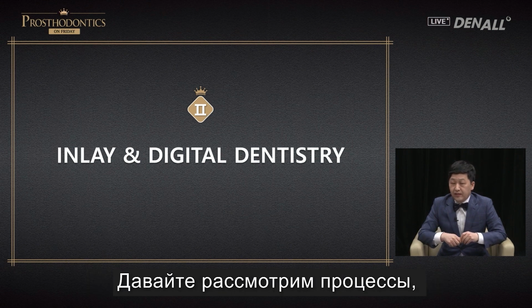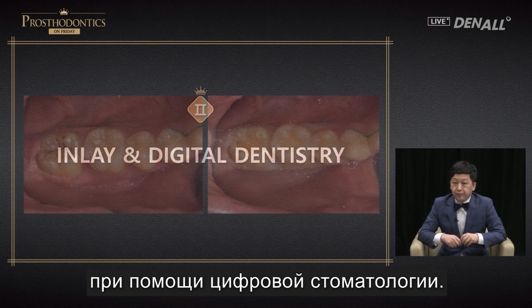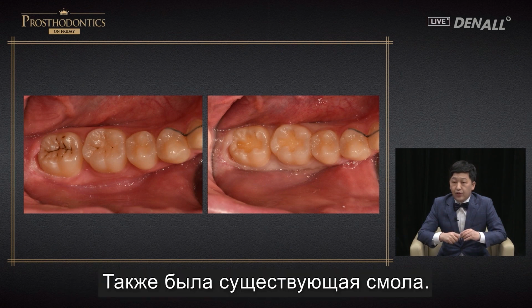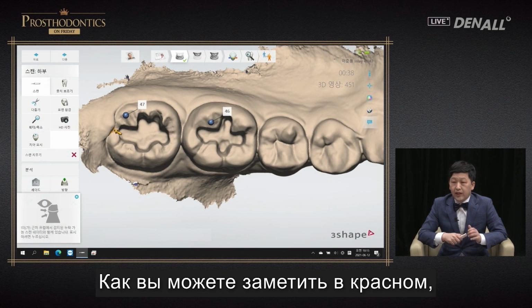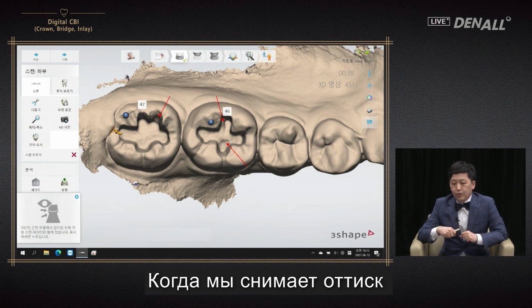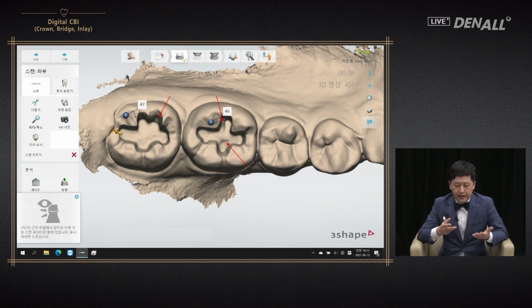Let's look at the processes involved in an inlay using digital dentistry. There was caries in number 6 and 7. There was existing resin, prep was done, and a scan was done. As you can see in red, the prep is quite insufficient. When we take an impression using analog methods, these are not shown well.